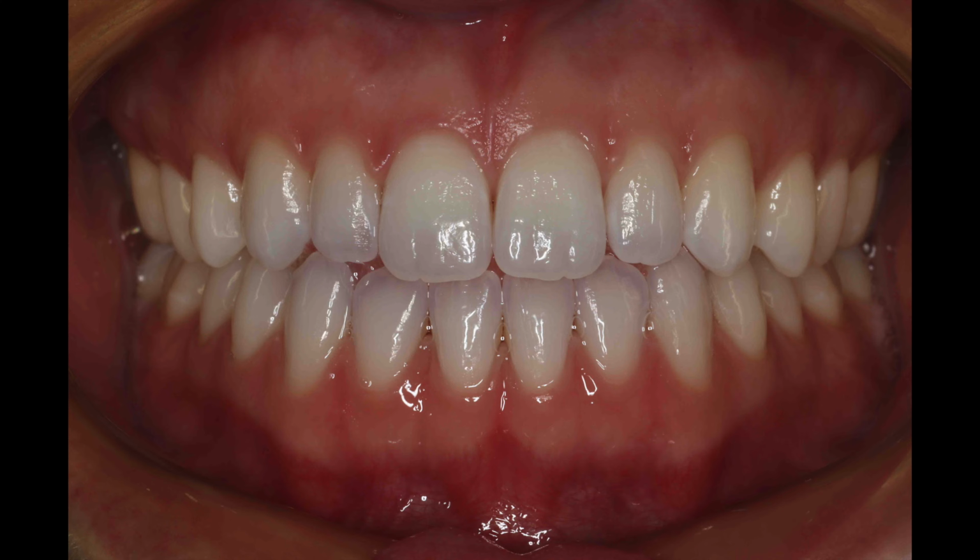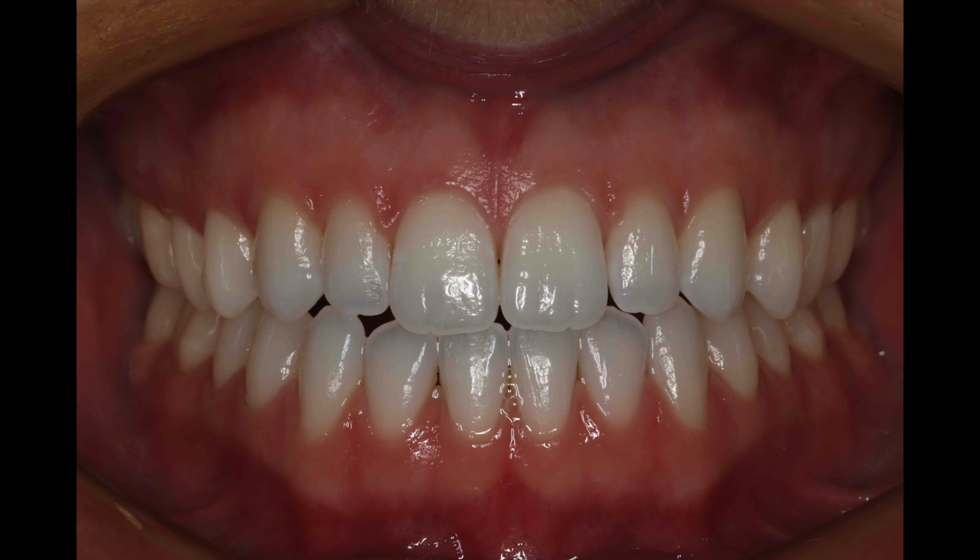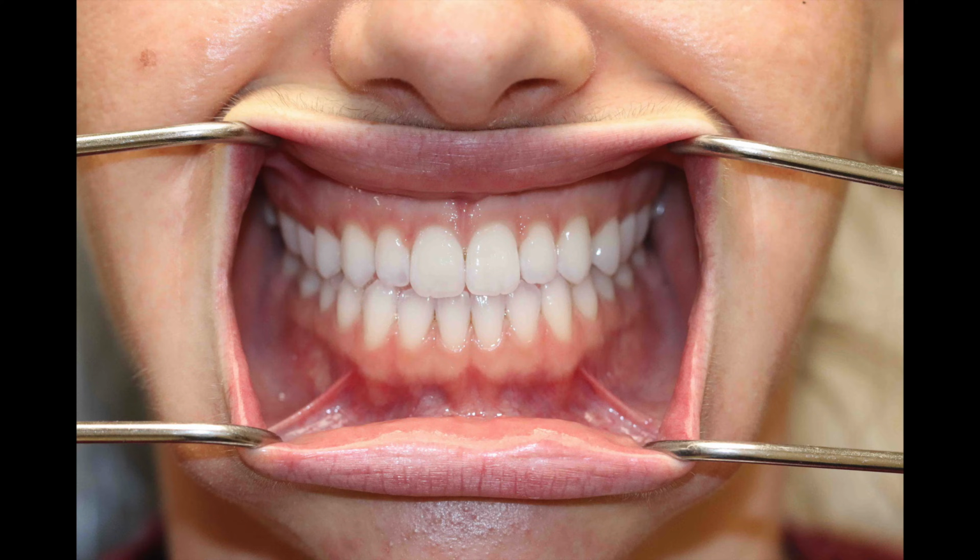When taking the photo, focus on the most anterior portion of the photograph. Here, that would imply the central incisors. This photo illustrates the tendency of the lip to bow inward when the retractors are not held outward towards the camera. Here, the photographer did not center the midline of the teeth, and she did not zoom in enough.